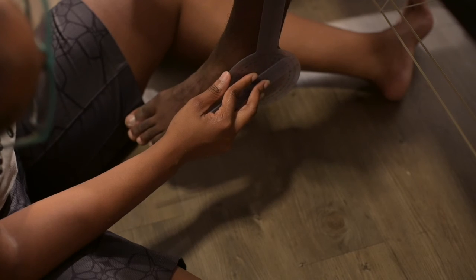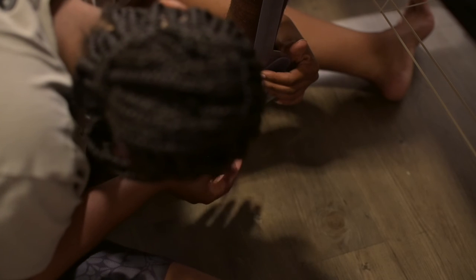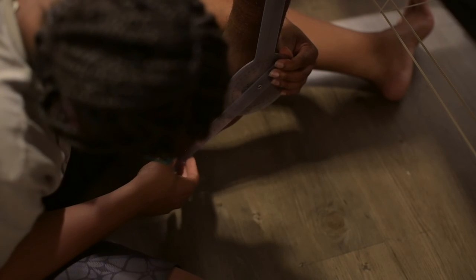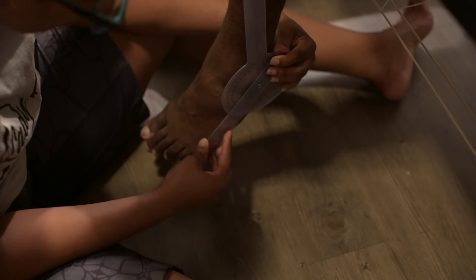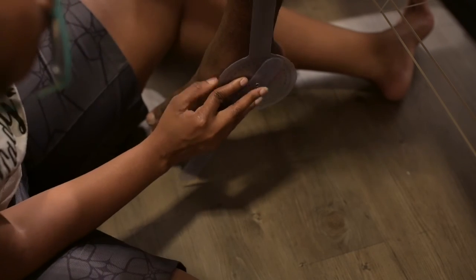So there's our stationary arm, and the mobile arm is aligned with the fifth metatarsal. So go ahead and plantar flex again. Keep it there for a second. Redo this.